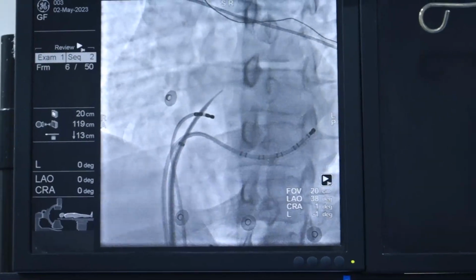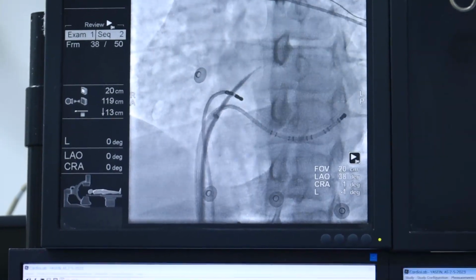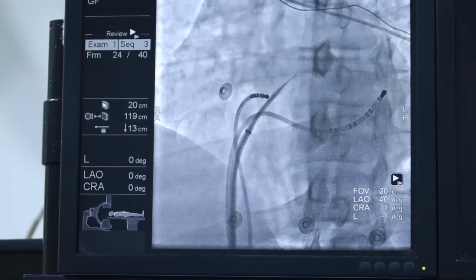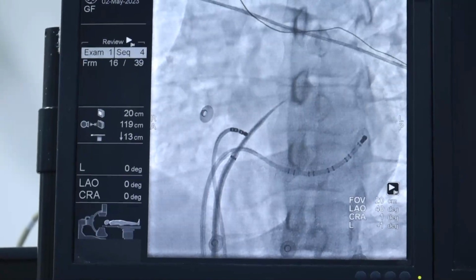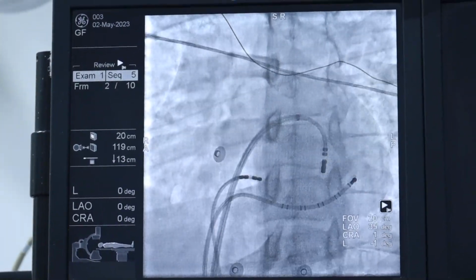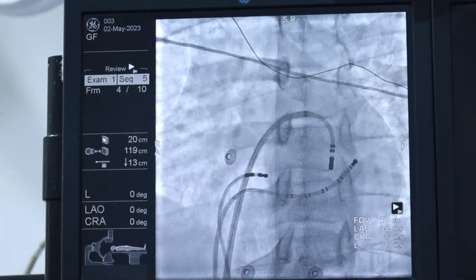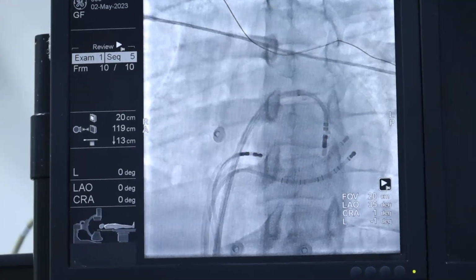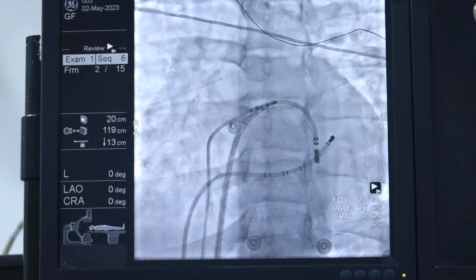We'll show you the fluoro picture. This is the transeptal puncture guided by the His catheter. This is the LAO view of the transeptal. We use contrast, and sometimes we use cautery, and we push the contrast through the needle in order to make sure that you are in the left atrium. This is the ablation catheter with the sheath in the left side, and you can see we are directed to the CS 3 and 4.